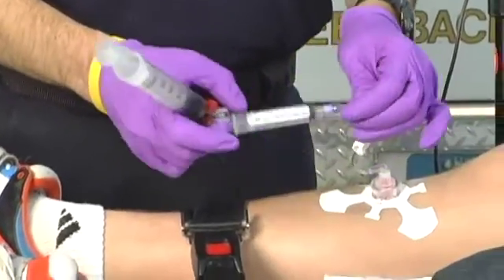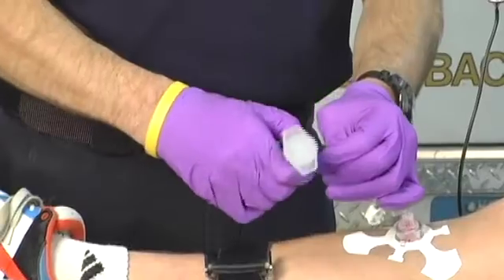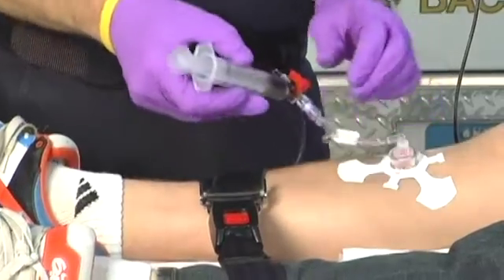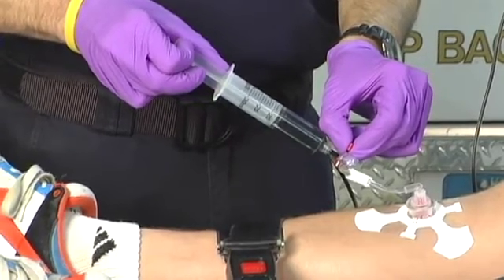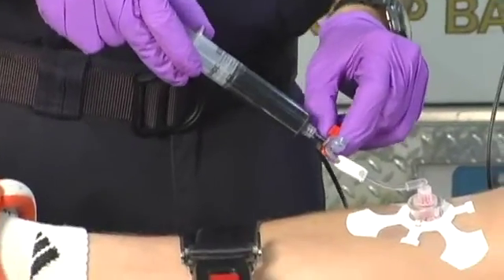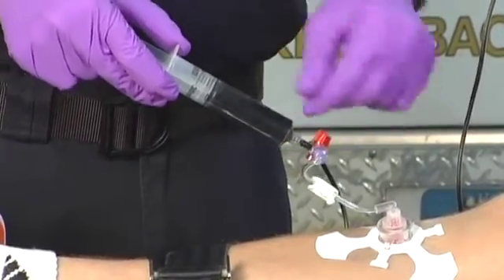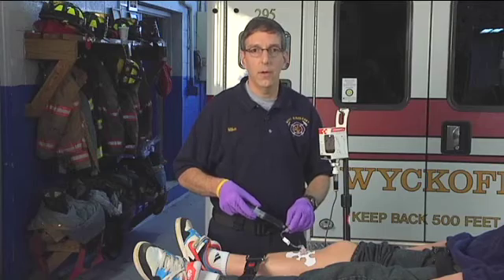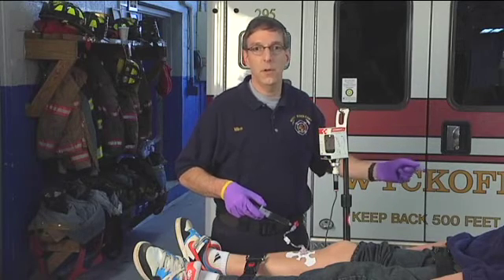We're ready to attach the stopcock to the intraosseous line. We'll remove the prior syringe and connect the stopcock to the IO line. Now we can pull medication into the syringe from the hanging bottle of hydroxycobalamin — Cyanokit — then turn the stopcock toward the patient and push the medication through the IO line. We continually turn back, pull from the bottle, turn to the patient, and push medication in, delivering it over seven and a half minutes, then use the same tubing to spike the second bottle of hydroxycobalamin.